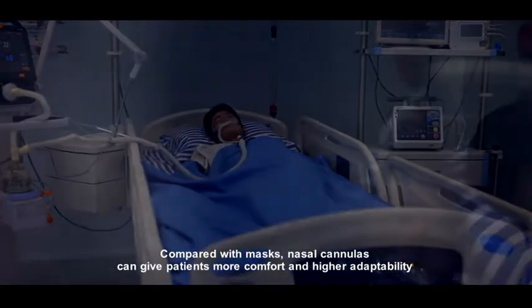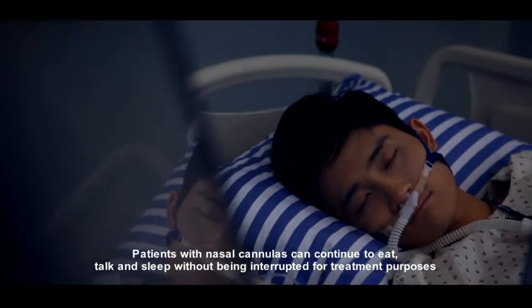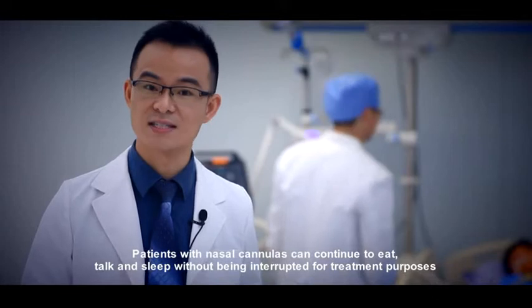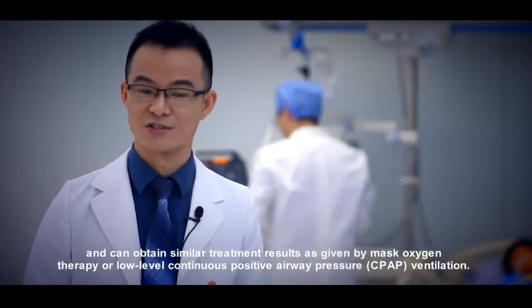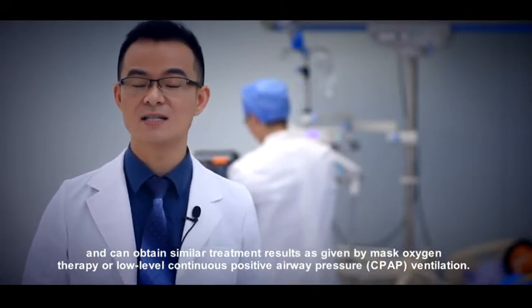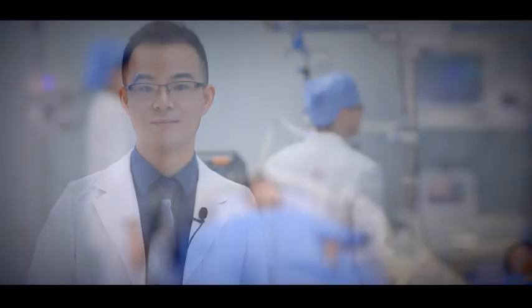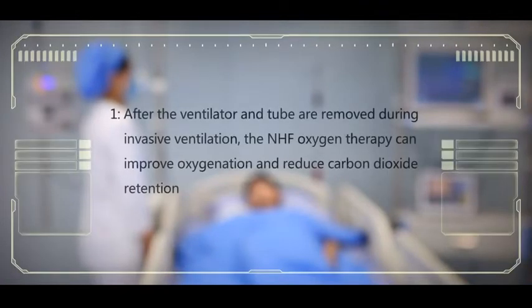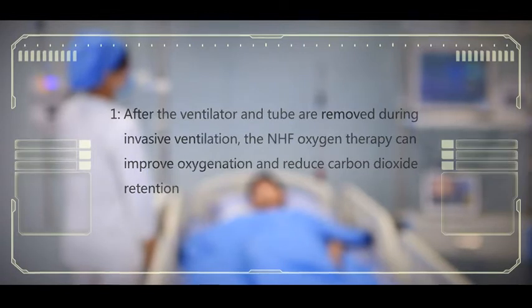Compared with masks, nasal cannulas can give patients more comfort and higher adaptability. Patients with nasal cannulas can continue to eat, talk, and sleep without being interrupted for treatment purposes, and can obtain similar treatment results as given by mask oxygen therapy or low-level continuous positive airway pressure (CPAP) ventilation. Recent clinical studies have shown that after the ventilator and tube are removed during invasive ventilation, the NHF oxygen therapy can improve oxygenation and reduce carbon dioxide retention.